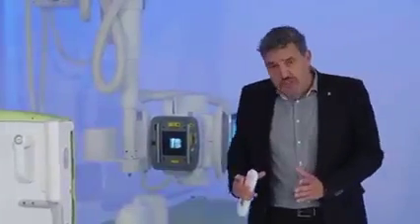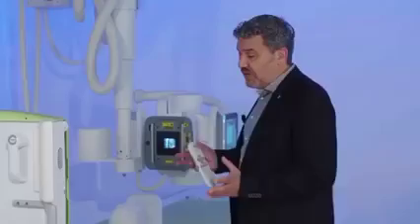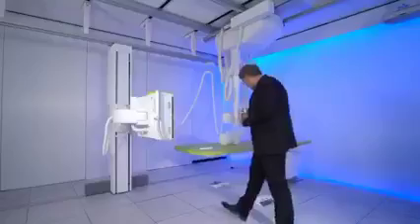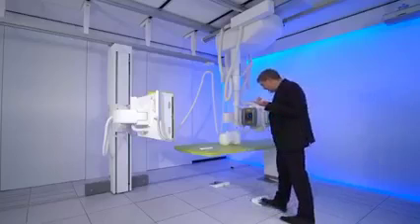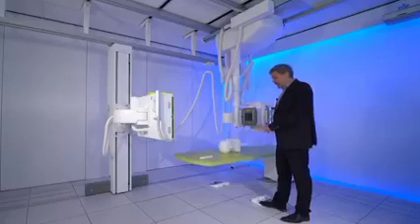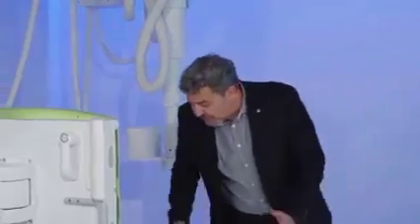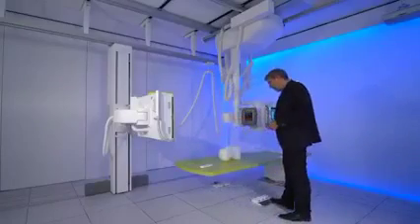The problem is those little stools are not comfortable. For the patient, it's very difficult to keep your balance. And as a radiographer, you always get nervous about how is this patient going to sit on the stool for a longer time. When you have a solution like this, it's much easier. You can lower the table to any height, even if the patient is capable of sitting and coming out of a wheelchair. They will sit on this tabletop.